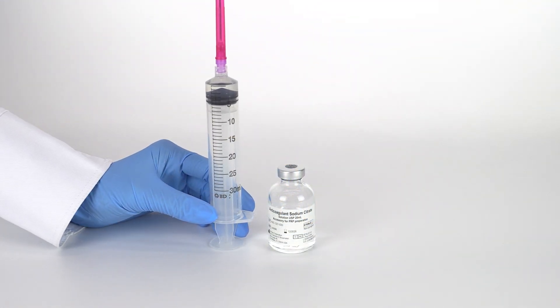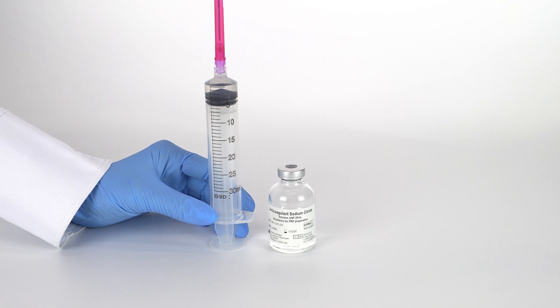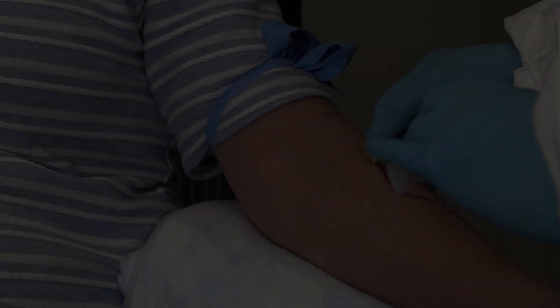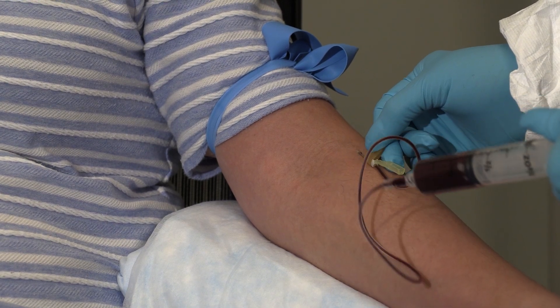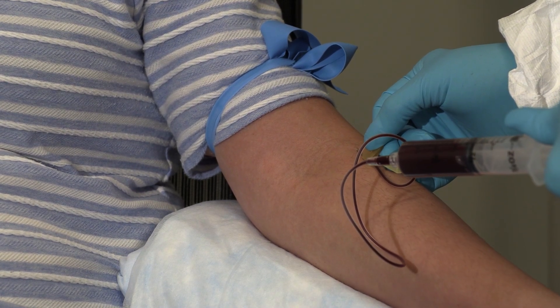Fill a 30-milliliter sterile syringe with 3 milliliters of citrate anticoagulant. Then draw 27 milliliters of blood from the patient, filling the syringe to 30 milliliters.